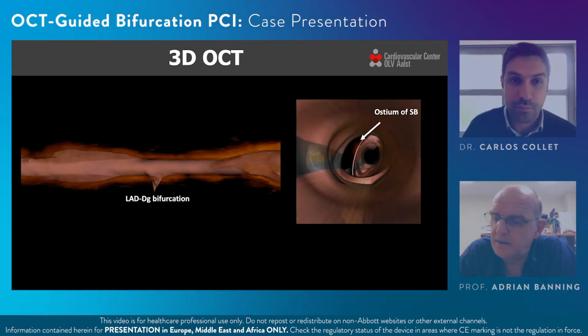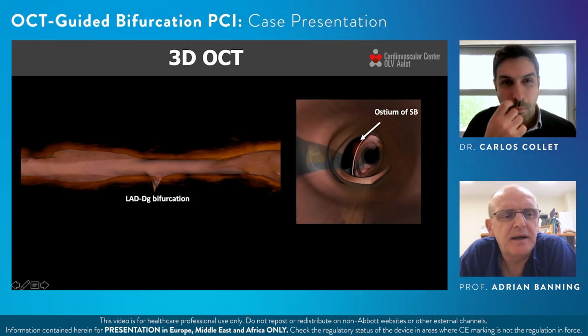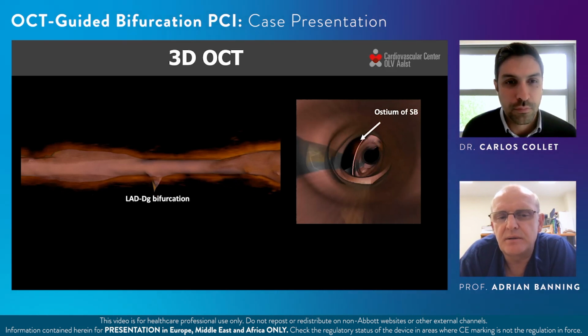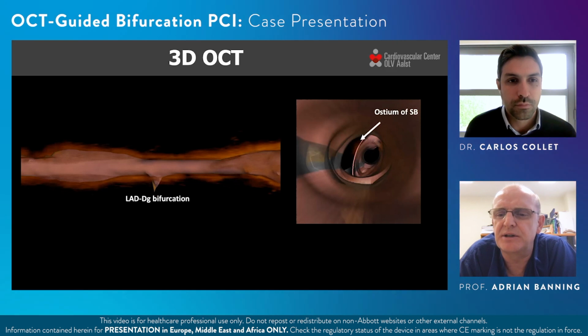Great, thanks, Nicolas. I guess the key question for me here is whether the initial stents are properly expanded or not, and what the contribution of in-stent restenosis is. It's interesting that this is a long time since the stents were placed, so it's a slightly unusual presentation. This is some 10 years or so since the original stents.